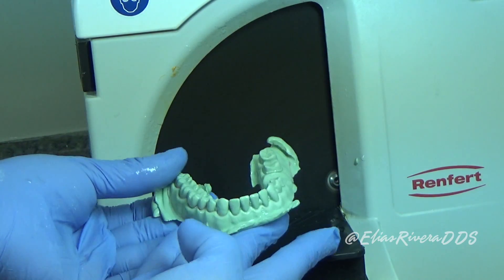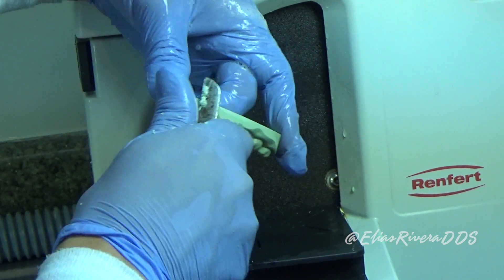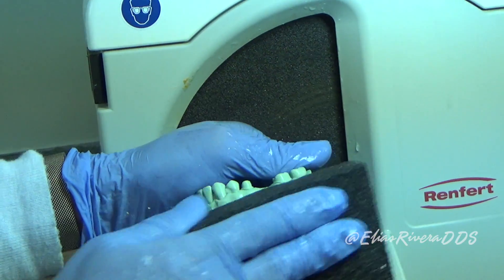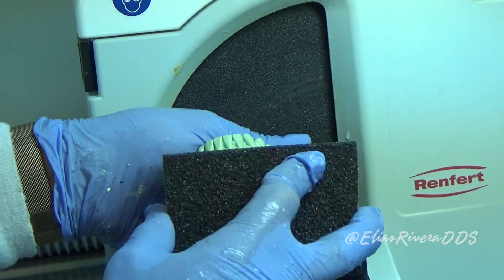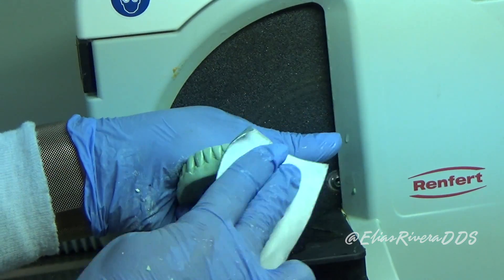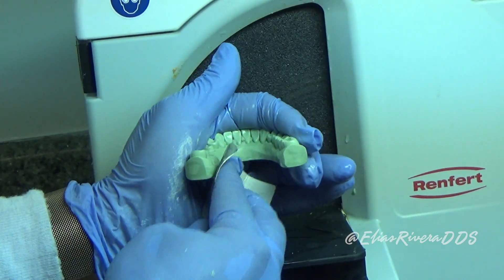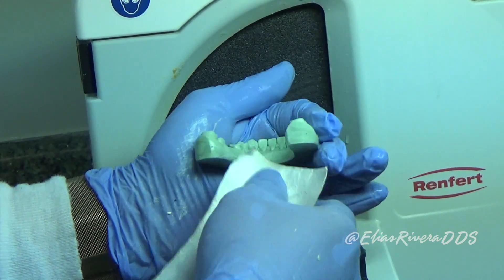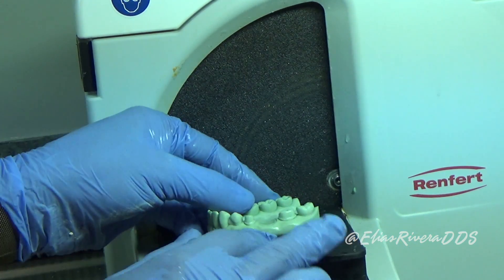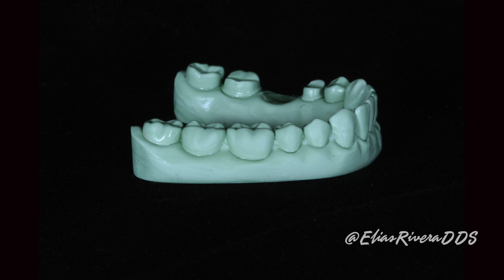It's important to keep the base parallel to the occlusal plane. In this picture, you can see that red line and its relation when trimming the model. After the trimming is complete, we're going to start cleaning the borders using a buffalo knife. The idea is to get a slight taper from occlusal to gingiva. It's important to keep this surface very smooth — for this, we can use sandpaper. This is the cast properly trimmed with a horseshoe outline and 10 millimeters from the gingival margin.